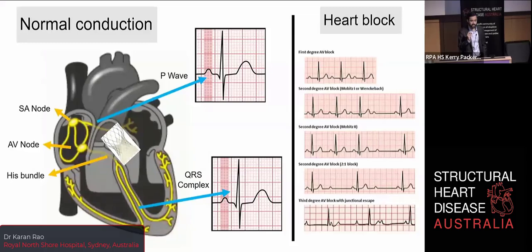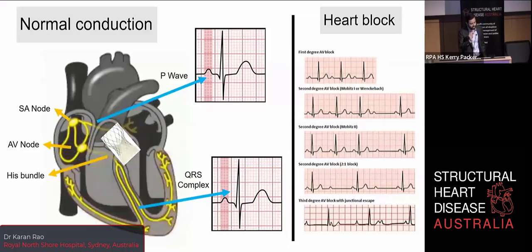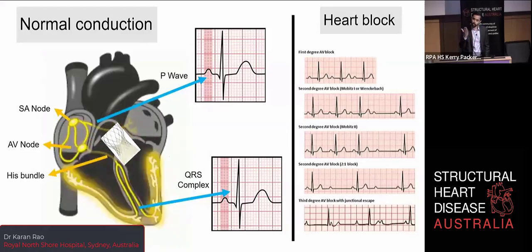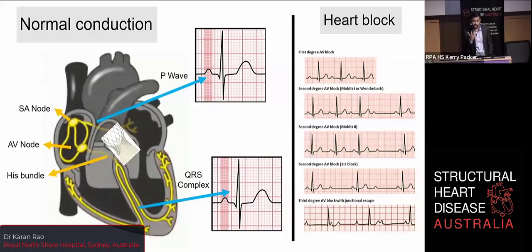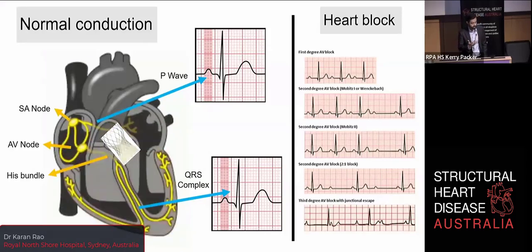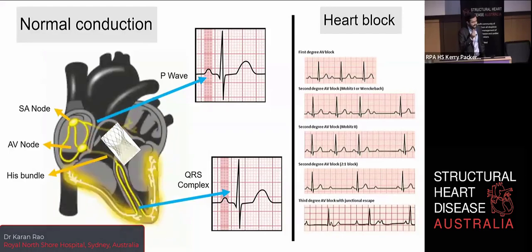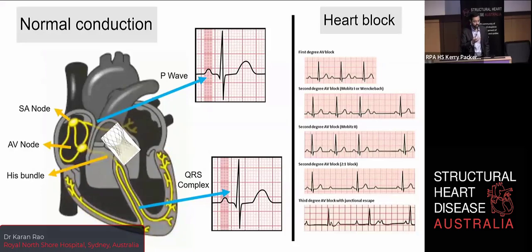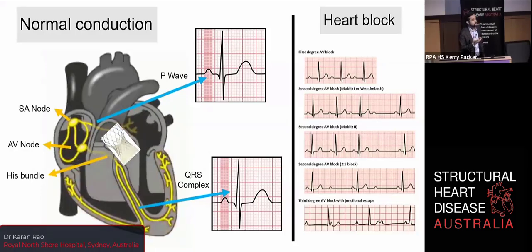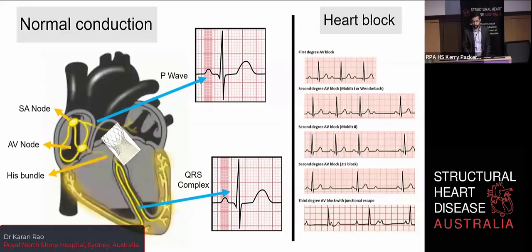More specifically, the membranous septum is the non-muscular thin portion of the interventricular septum that's located on the septal aspect of the LVOT and located between the non and right coronary cusps. It's particularly prone to damage or interaction with a transcatheter heart valve. And it's the fundamental reason why you get complete heart block or a left bundle branch block following TAVI.